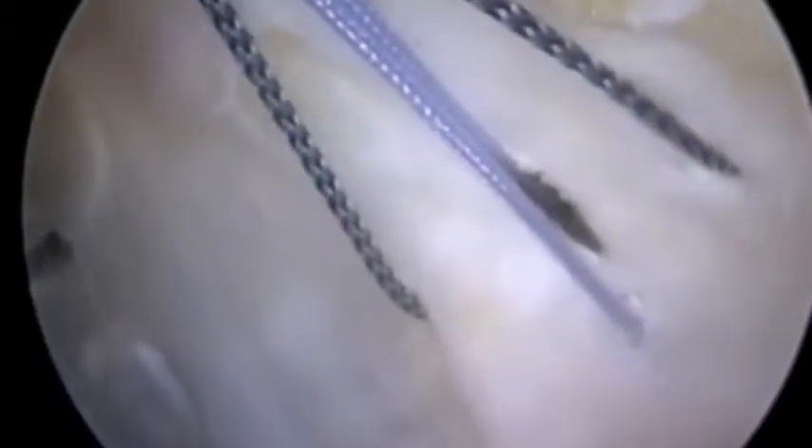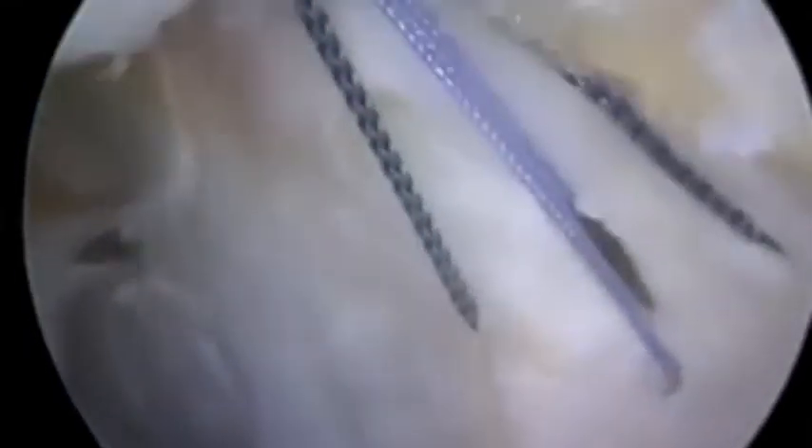After the release, the patella comes over nicely into the groove, and here we can get the lateral aspect of the patella to match up with the trochlea. Here are the sutures that haven't been tied yet.